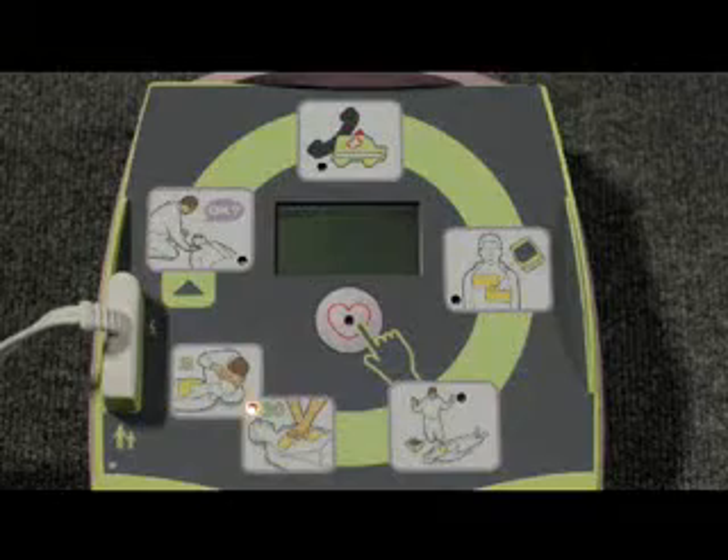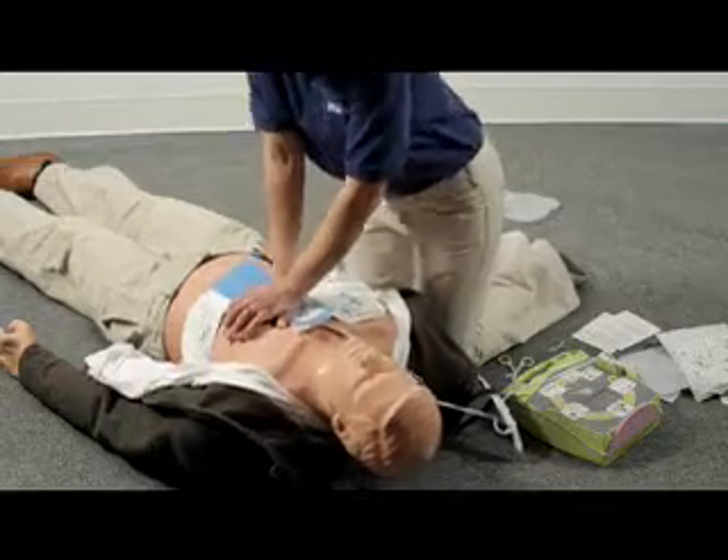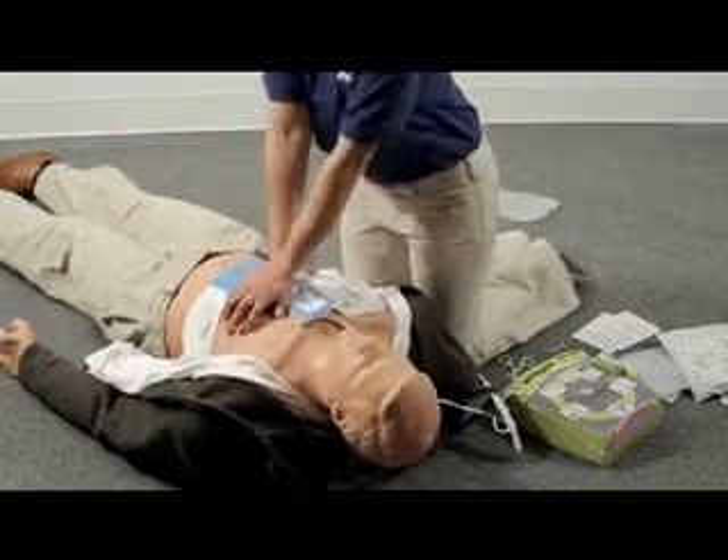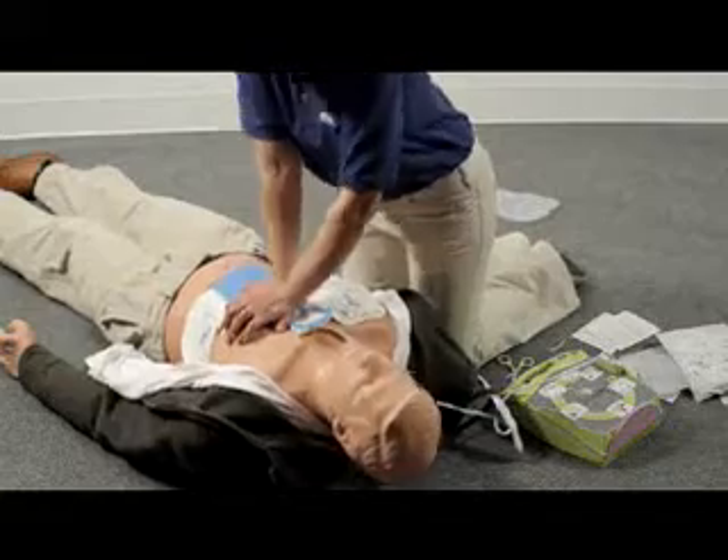After giving 30 compressions, you should give two rescue breaths. Repeat this cycle of 30 compressions followed by two rescue breaths until the AED Plus tells you to stop CPR.